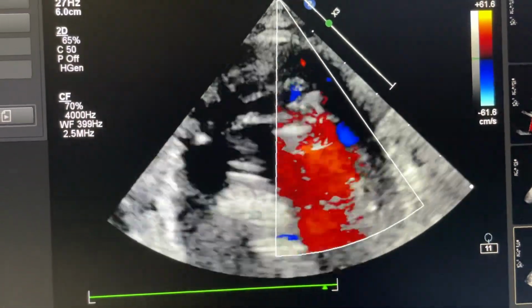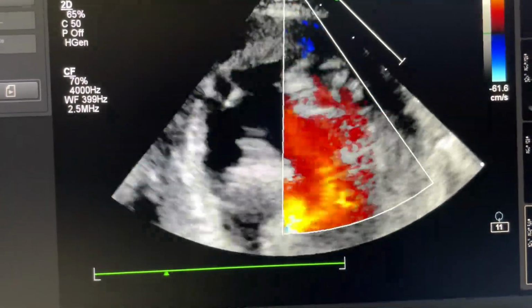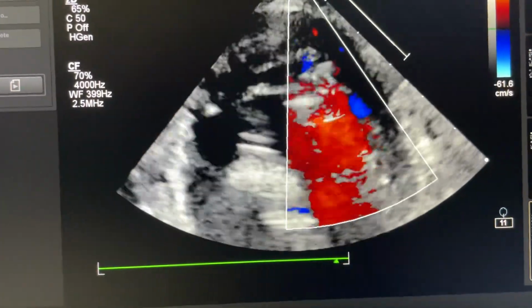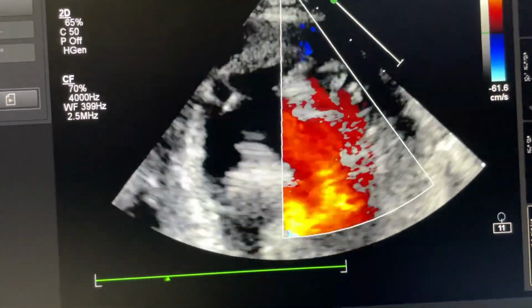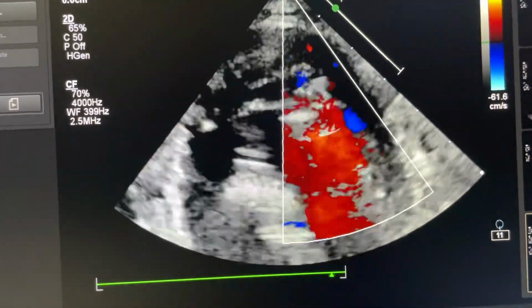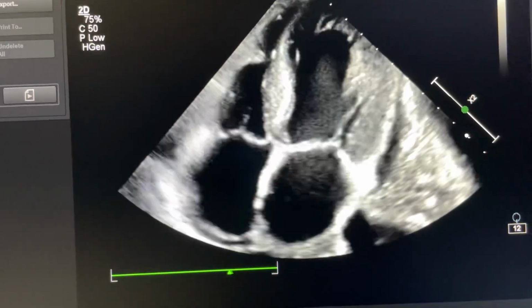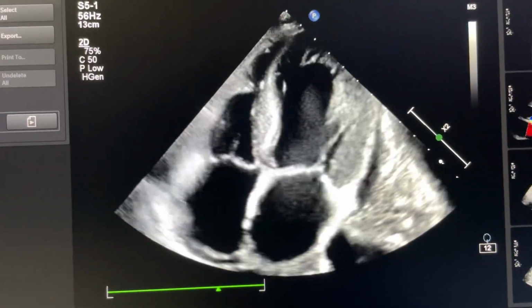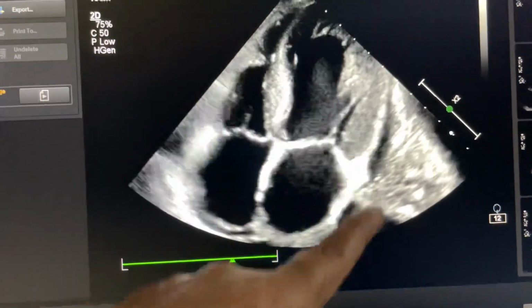Your learning from this video is, whenever you find pericardial effusion in case of myocardial infarction, you have to rule out rupture. The rupture is likely finding in that case. Anterior wall MI, pericardial effusion. You can find out easily the pericardial effusion. All chambers are dilated.